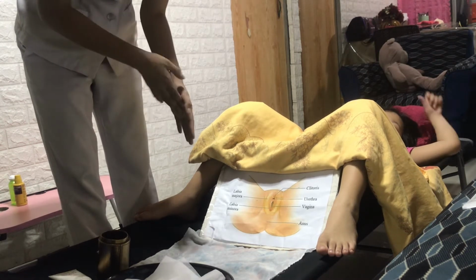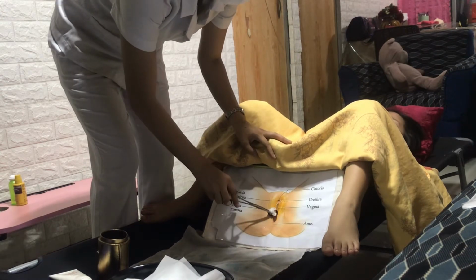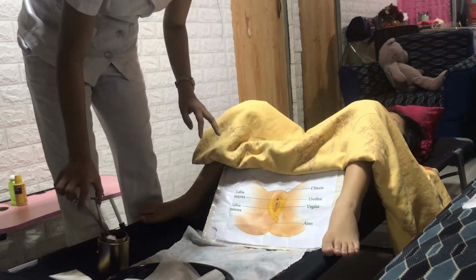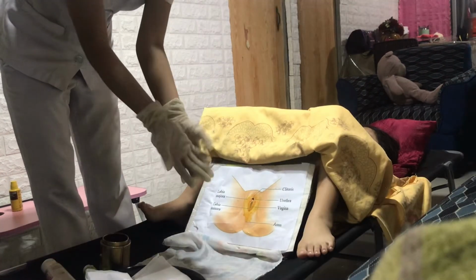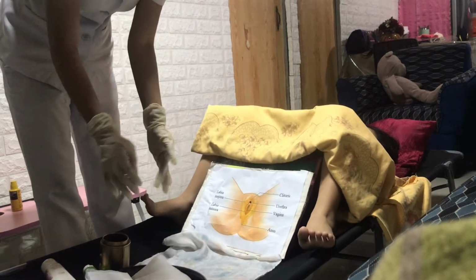Using a sterile forceps, cleanse the area using a cotton ball with betadine. So this is the cotton ball with the betadine. And then discard. Alright, since we already put on the new sterile gloves, I will be putting the eye sheet afterwards.